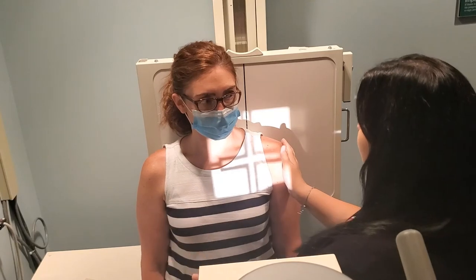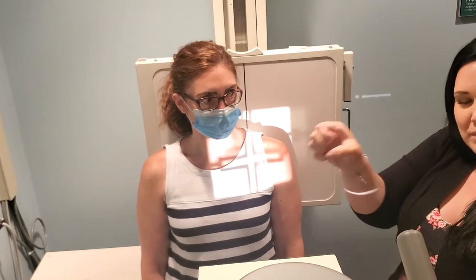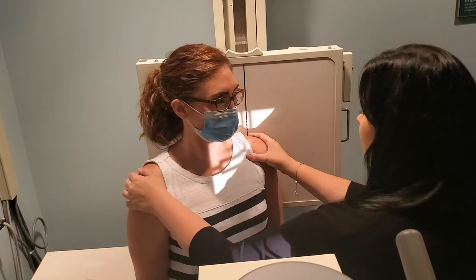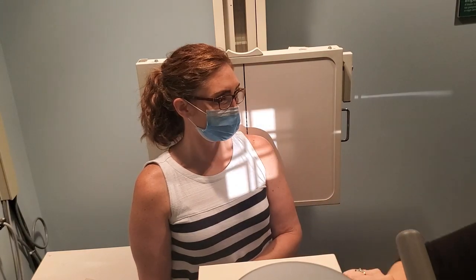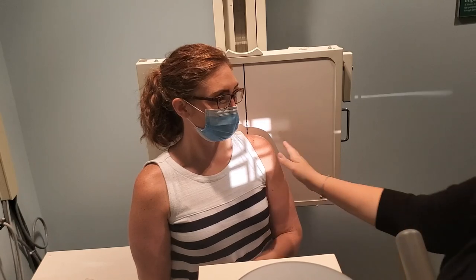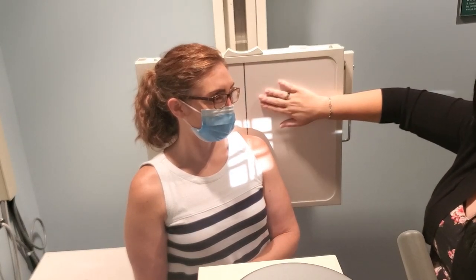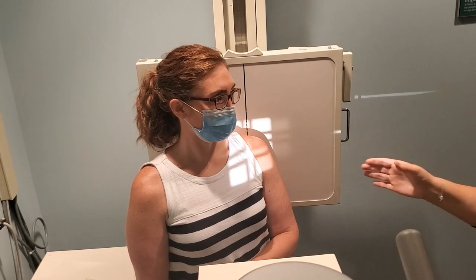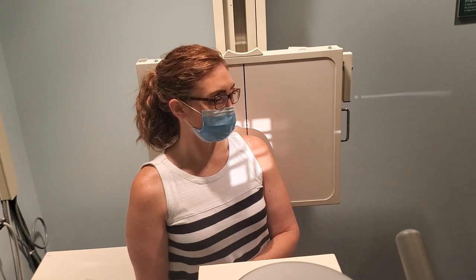So again, starting in AP, hand on the outside of the shoulder, dropping that thumb in. You don't have to squeeze really hard — that just rests in there. Obviously if somebody has shoulder pain, you're not going to want to be clenching on them. Turn the patient so your nail bed is perpendicular to the IR and parallel to the CR. Take the affected side's hand and rest it on the abdomen. Because you're only looking for that joint space, you can collimate in really tightly to just the edge of the humeral head and the surrounding joint space. Put a marker right in the light field — the left marker because the left side is down and that's the side of interest. This is still a 10 by 12 inch cassette, and again, 35 to 45 degrees rotation. Try that thumbnail trick to help get a gauge of where you want to center and direct your patient.